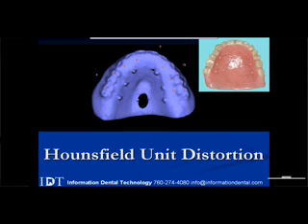And if we've been doing this for years, so we're able to pick a good threshold to be able to make them fit well. And actually, I would say about 85 to 90% of our cases are utilizing only DICOM data and only the DICOM technology.